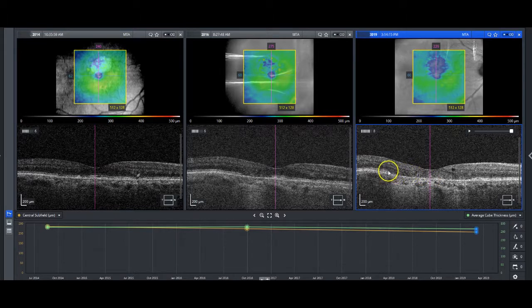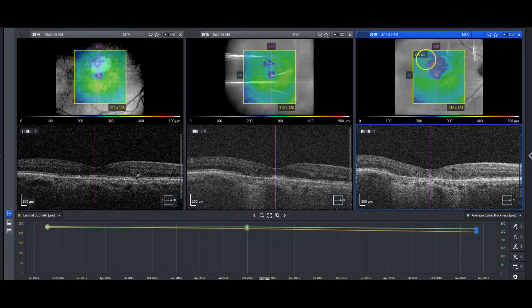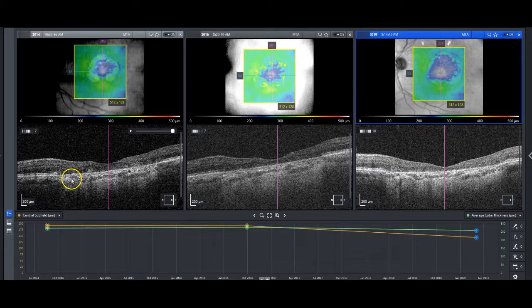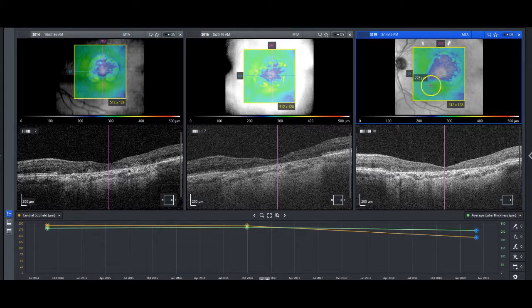But certainly by OCT, you can tell that there's ellipsoid zone loss and a lot of atrophy throughout. Here as well is an outer retinal tubulation — that's what that circular structure is right there. And easily on the map, you can tell that the area of geographic atrophy has expanded. Just for the sake of interest, we'll take a look at the fellow eye, and you can pretty much see the same story here — an expansion of the extent of geographic atrophy over time, from 2014 all the way out to 2019.